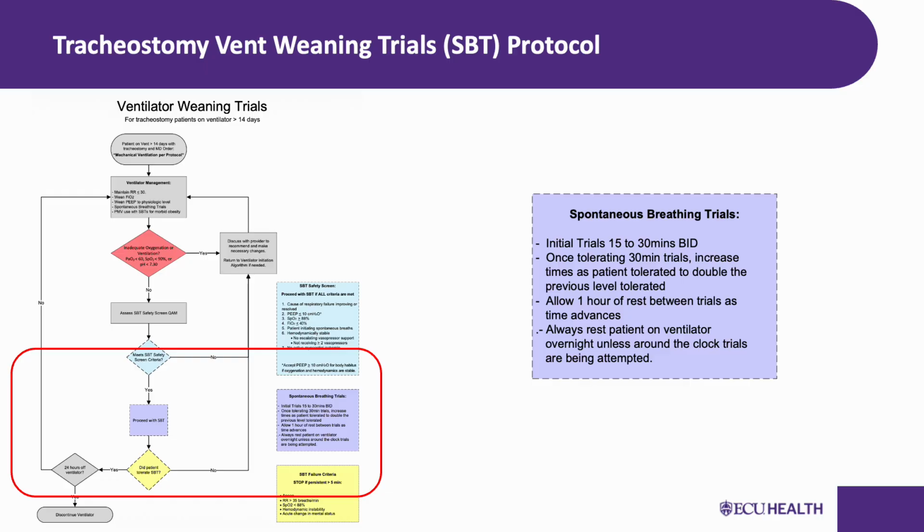And here is a crucial rest requirement. Always rest the patient overnight on the ventilator. Sleep is when the body recovers and the respiratory muscles repair. You don't want to fatigue a patient all day and then keep them off the ventilator throughout the night. The only exception is when around-the-clock trials are being attempted, which could be a specific clinical decision made by the provider team for patients who are very close to complete ventilator independence. This is a marathon, not a sprint, but with consistent daily trials and progressive increases, these patients can achieve liberation.